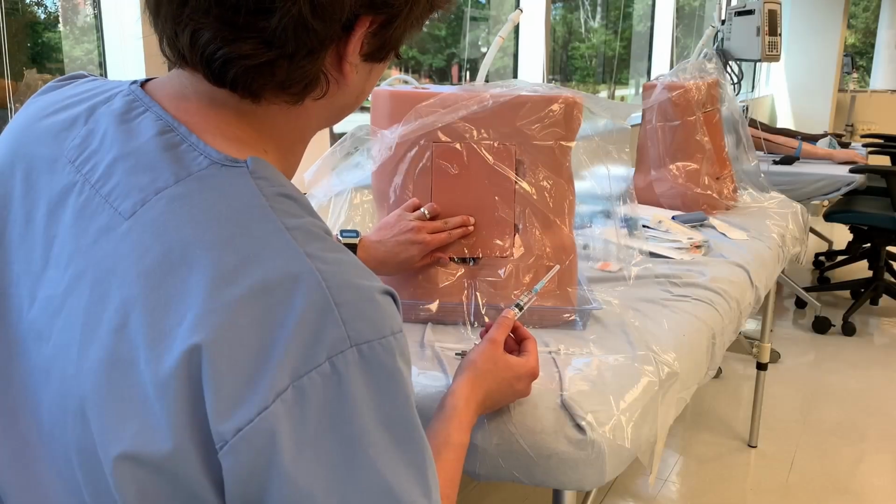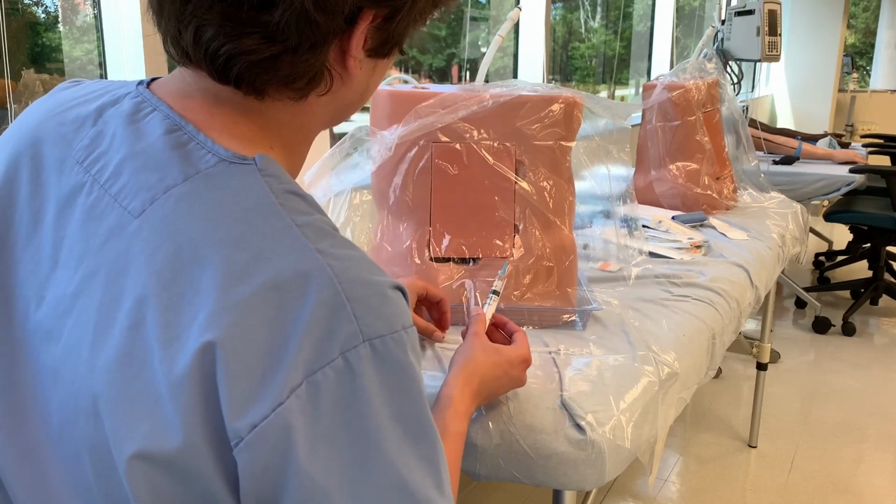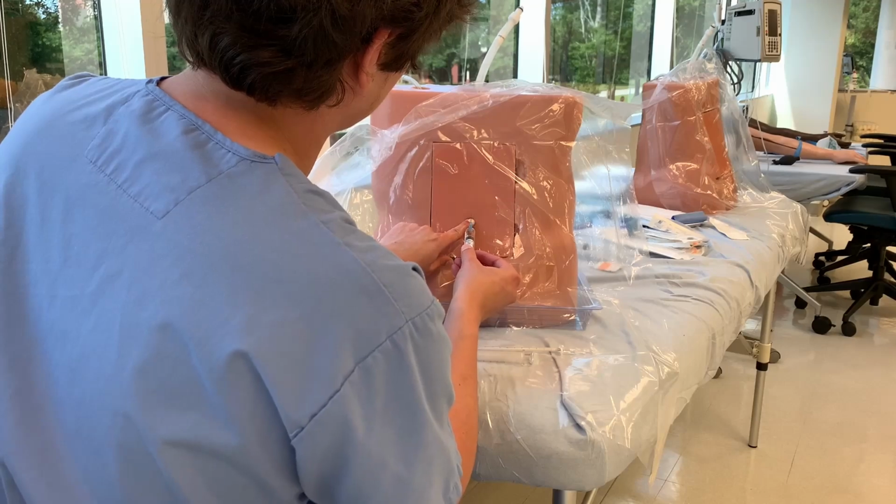Now for an epidural, it's going to start very similar to a spinal in the sense that it's going to be palpating landmarks and then anesthetizing an area around the injection site.